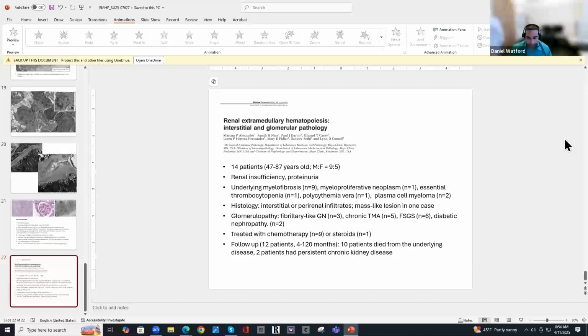There's a comment in the chat from Charlie Alpers: maybe the Congo red is a false negative, possibly stained for amyloid P protein. That's a very good comment. We haven't stained for the P protein, but it's intriguing that if it's a false negative, they also had a false negative when they reported their series. Yeah, it still remains a valid possibility, also given the thickness of the fibrils.